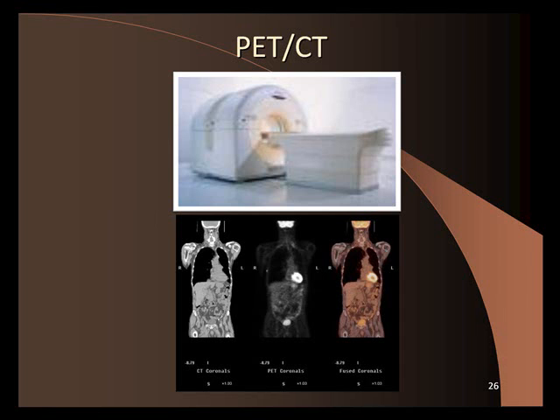But when you've got a PET CT, put them together, and there's the enhancement in PET here and down here, and you can overlay it on anatomy. Where does the color come from? The color just comes from the software. You can pick orange, green, whatever color you want. But what's important here is what's enhancing, what's bright and what's not bright.